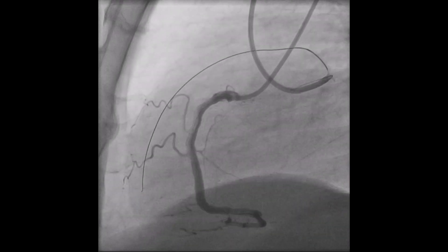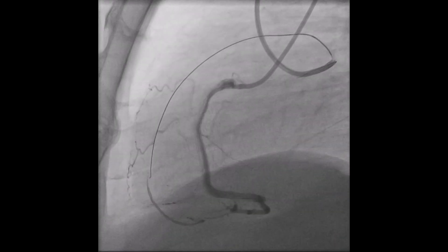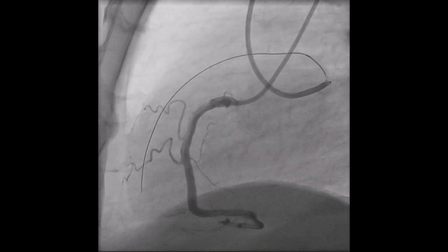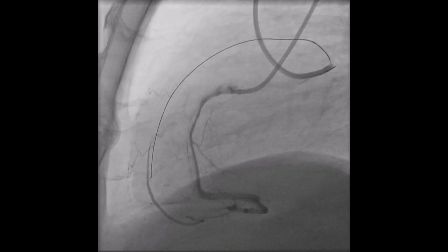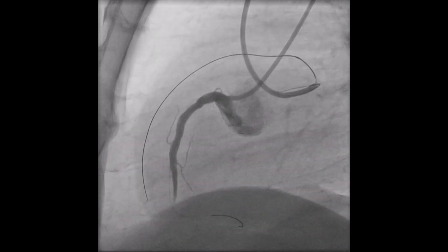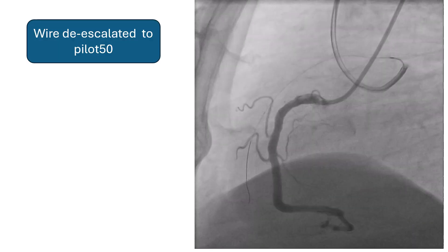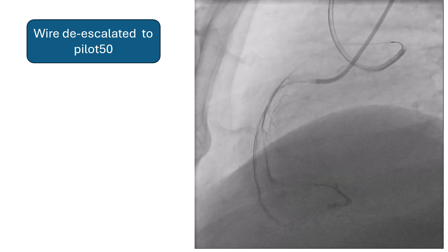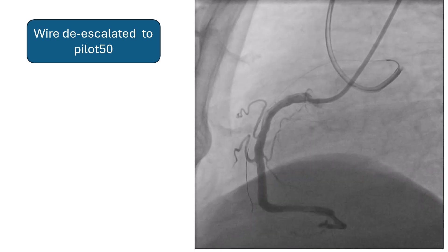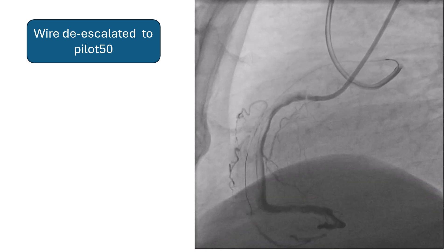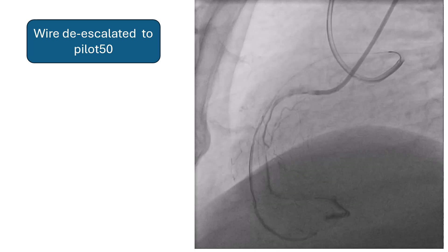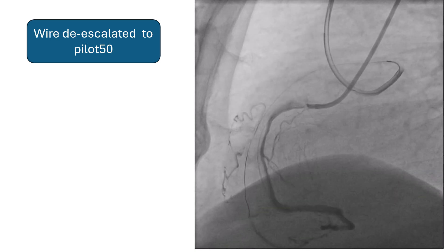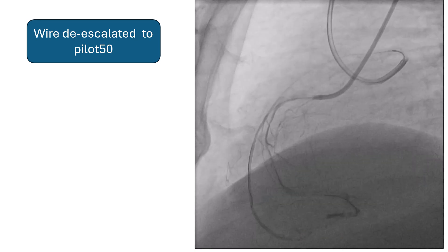And here comes another benefit of dual injection — the wire was actually in the wrong place. What we did at this point is that we de-escalated the wire to Pilot 50, and we were able to navigate the tortuosity in the lesion and in the track that was created by the previous wire, and so entered the true lumen.